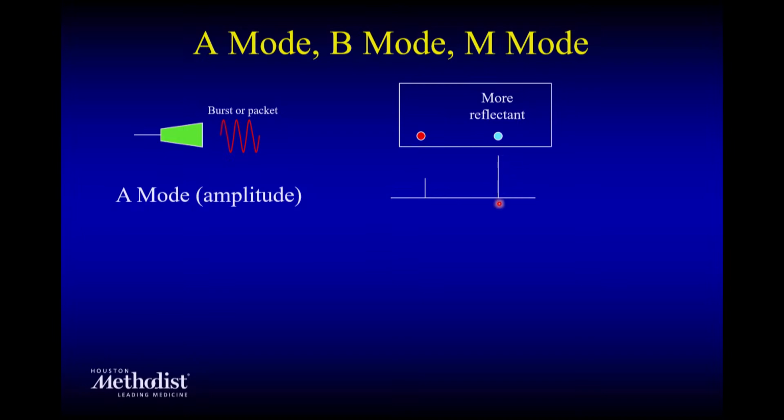And if I flip this angle towards you, it becomes brightness, right? What this brightness tells me is that whatever that structure is, it is more reflective of ultrasound compared to this other one. Take extremes: calcium versus soft tissue versus almost non-reflective, which is blood.